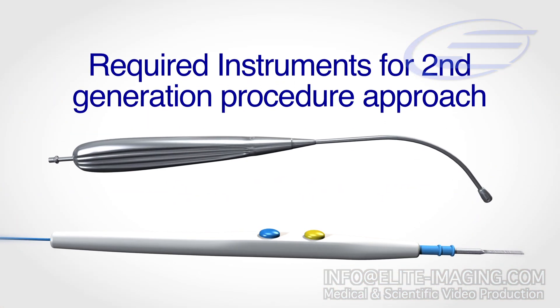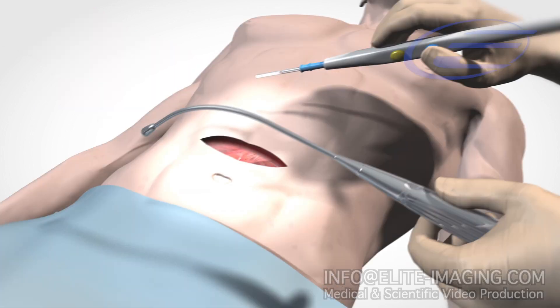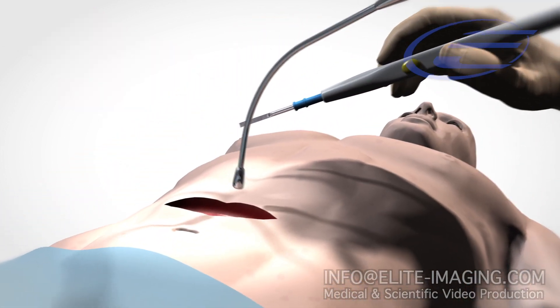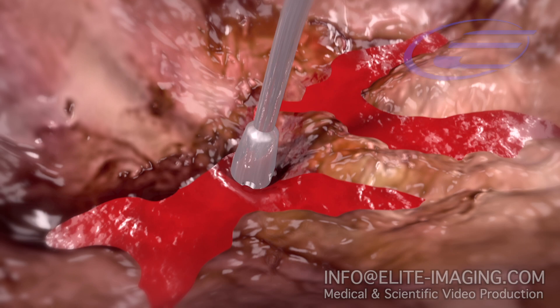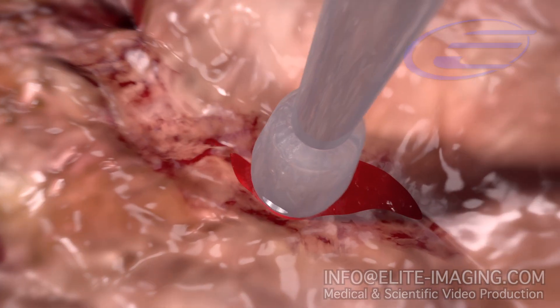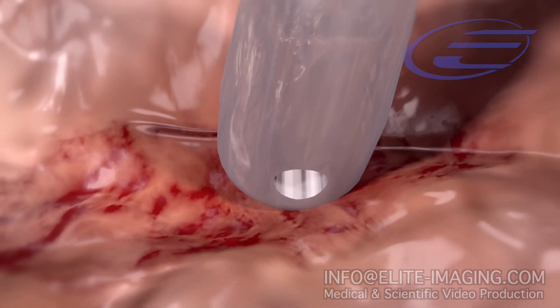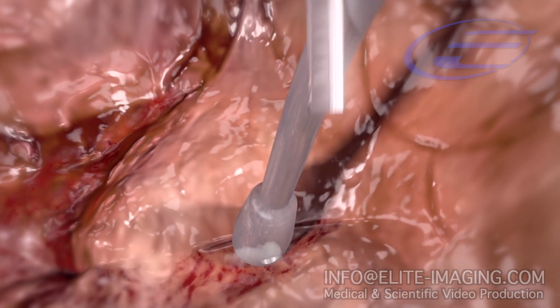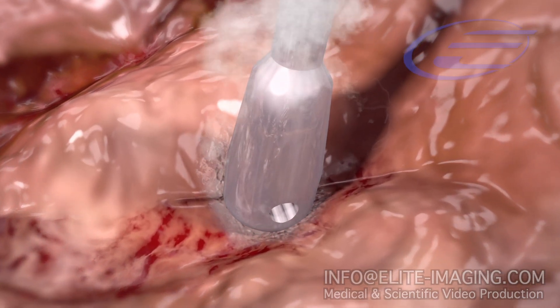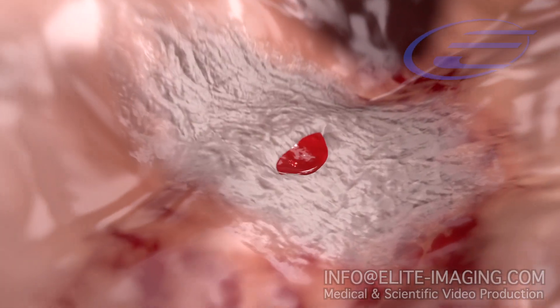Alternate efforts to streamline this process include the use of an existing metal suction and cautery device alone, eliminating the need for forceps. As before, suction clears the field and allows for identification of the exact bleeding point. The metal suction device can then be used to conduct cautery energy to the bleeding point applied by a second hand. Although this can effectively cauterize the bleeding point, the metal tip will adhere to the tissue, and when pulled away, the adherent cauterized tissue will separate and reinitiate bleeding.